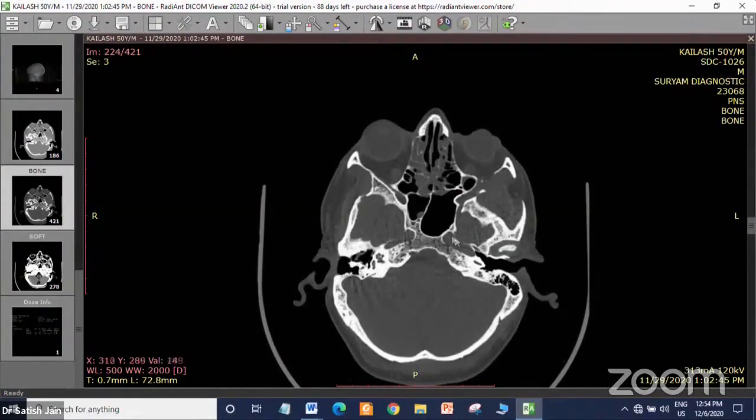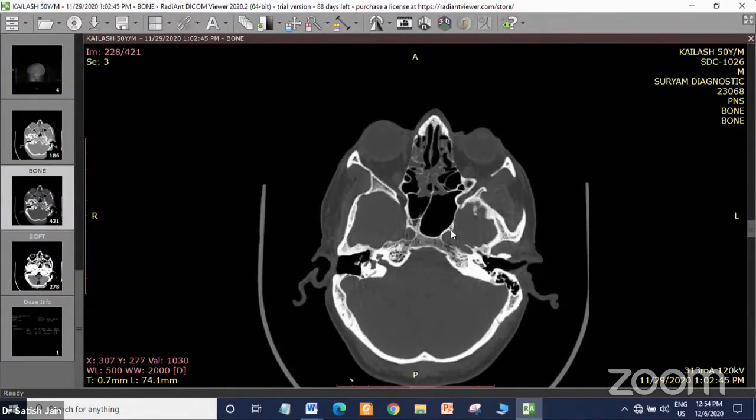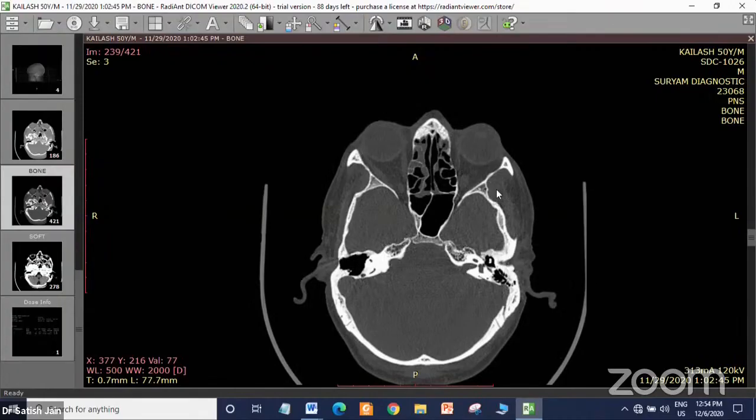This is the carotid artery. This is the prominence of the carotid on both sides. So radiology, you can ask me anything. I'm not going into detail myself. These were the fine points I touched upon. Any questions so far, so that we can go ahead with the case? Please go ahead with the case, sir.